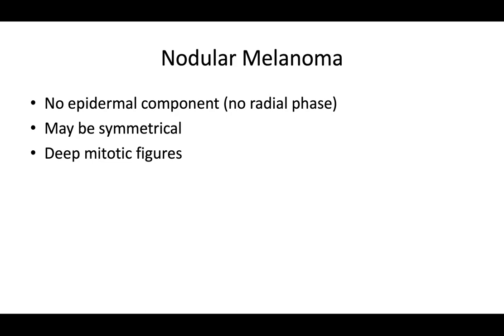And usually we'll go to 40x and we'll find an area of mitosis, and we'll start to count from there at 5 high-powered fields, and then add all that number together to get your number per square millimeter, depending on how your microscope is calibrated. But usually the mitotic activity is not as abundant as, say, a Merkel cell carcinoma, which you can have hundreds of mitotic figures in 1 square millimeter.